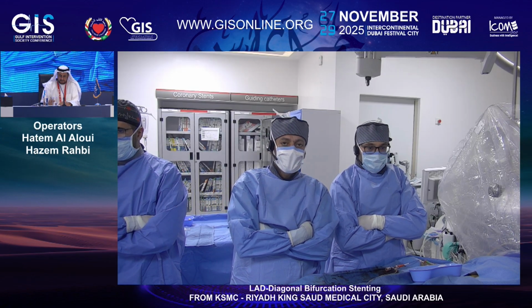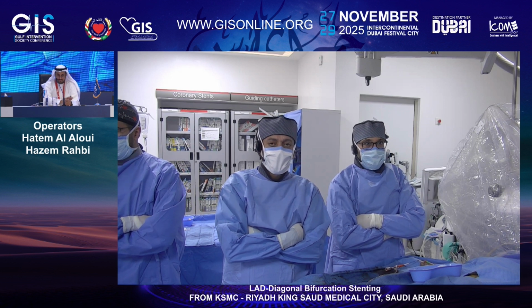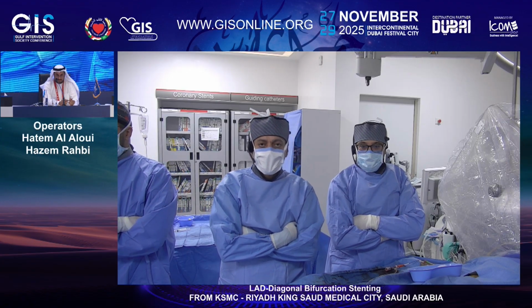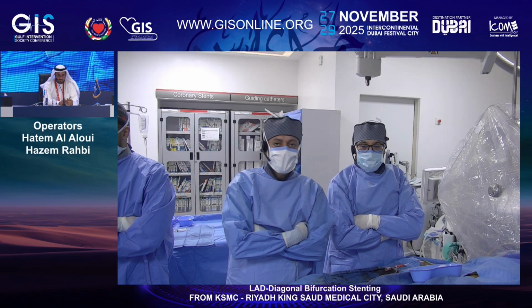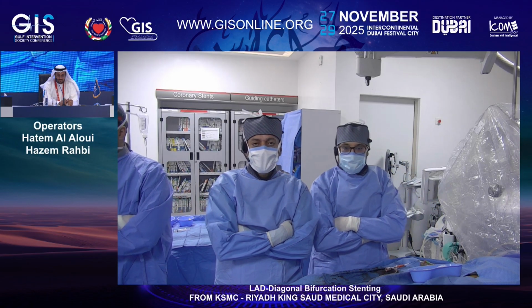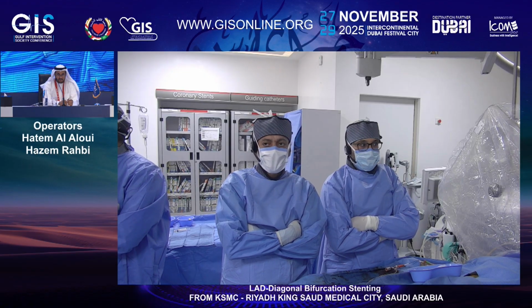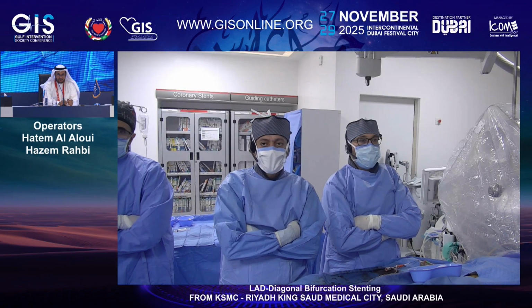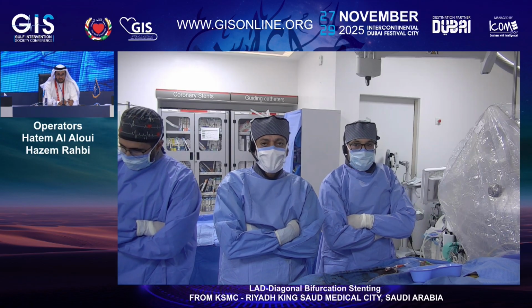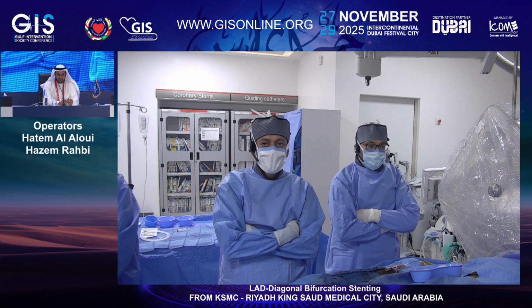I'm joined here by Dr. Hatem Aloui, the director of the Cath Lab. He will be the main operator of this procedure, and Dr. Hazem Rahbi, who's the head of structural in the center, and he's going to interpret the imaging analysis. I'm joined also by the scrub nurse, the radiographers, and also by the nurses and the anesthetist.